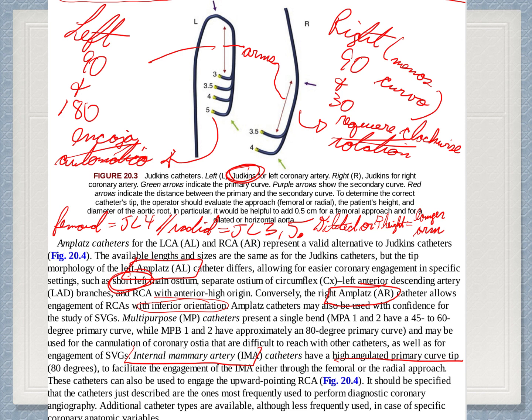So depending on the length you need or dilation of the aorta, for example, you might need different characteristics. In general, for femoral approach, a JL4, and for radial approach, a JL 3.5. So the difference in 3 to 3.5 to 4 is the length of the arm, which is between the primary and secondary curve.